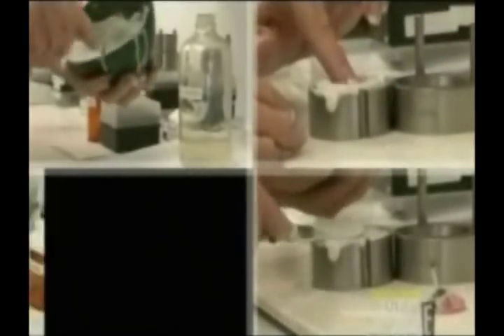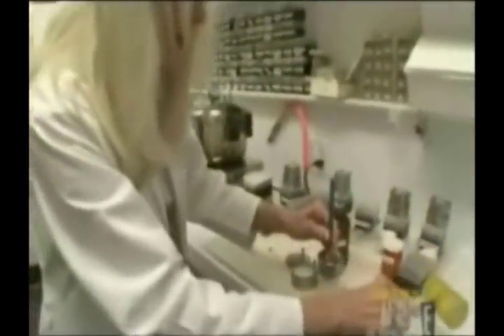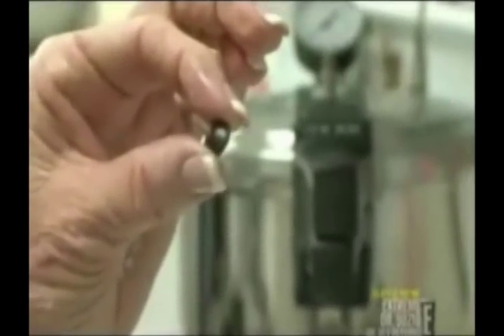I'm mixing the plaster to make the mold right. This is the pattern, and now I'm embedding it in the plaster. And down here is the pattern, and now we have a perfect mold to cast this into acrylic.